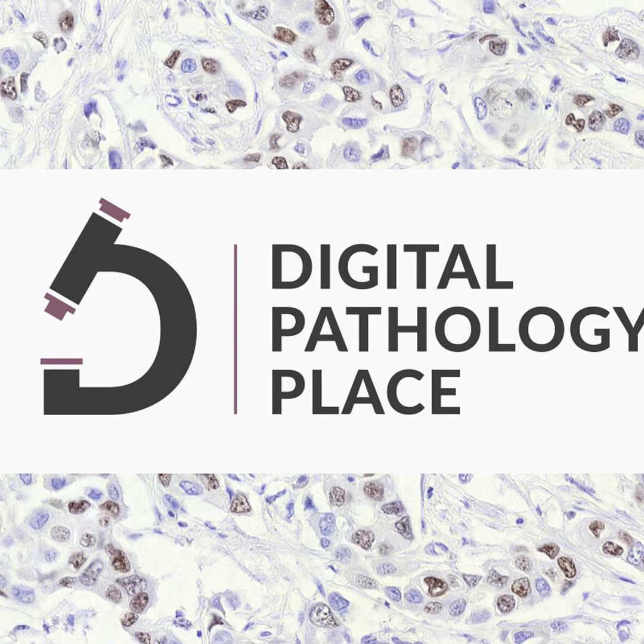I think in some cases you can actually do that. Where I don't believe it will work is, for example, you can learn the morphological patterns of lymphocytes, right? So predicting a CD3 stain from H&E will still mostly be feasible. Not perfect, but feasible. But doing a CD8 prediction relative to the non-CD8 CD3-positive cells, I think that's impossible. This information is simply not in the morphology. So you have to be a bit careful with the application there, I guess.